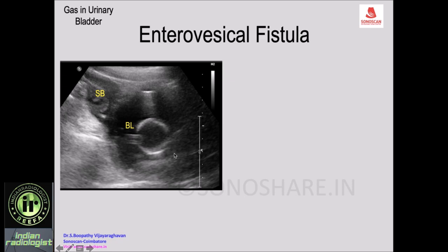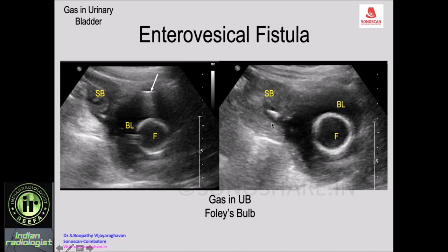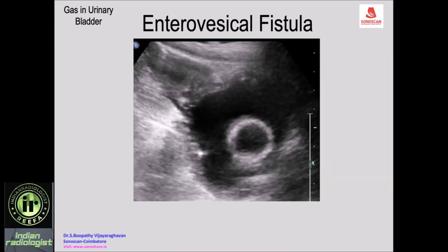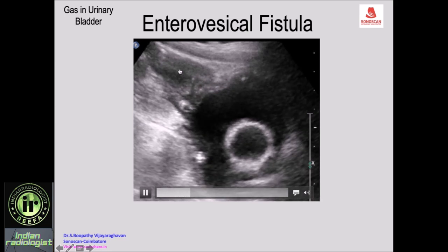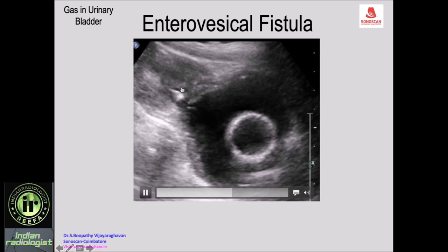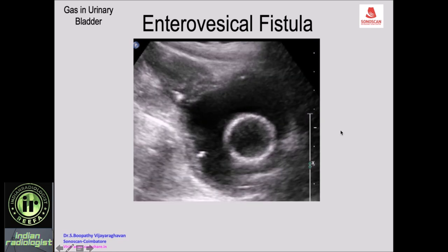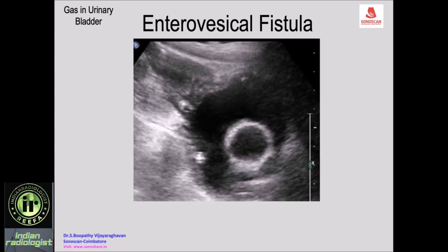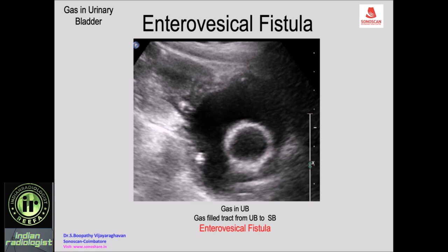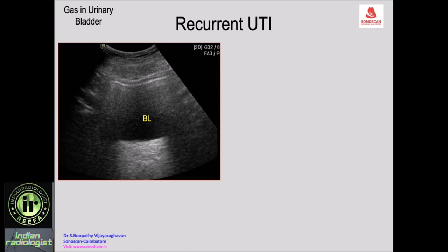A patient with urinary symptoms had a catheter in place with recurrent urinary tract infection. The bladder shows gas and a Foley bulb, with a thick-walled small bowel loop adjacent to the bladder with an ill-defined interface. Closer inspection shows continuity between the bladder lumen and the small bowel with gas — possible enterovesical fistula. In real time, with probe pressure, contents of the small bowel with gas flow into the urinary bladder through the fistulous tract, confirming an iatrogenic enterovesical fistula due to insertion of the Foley bulb.